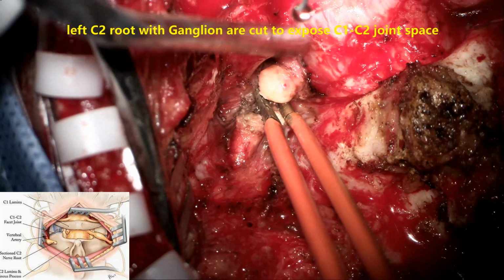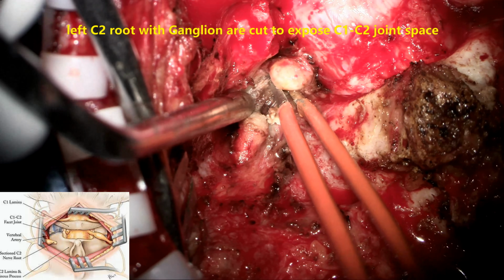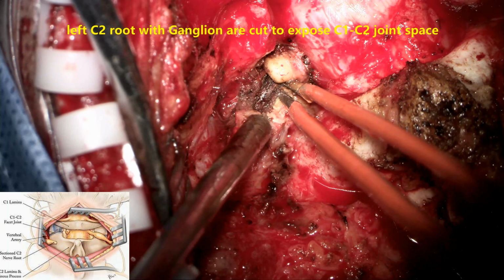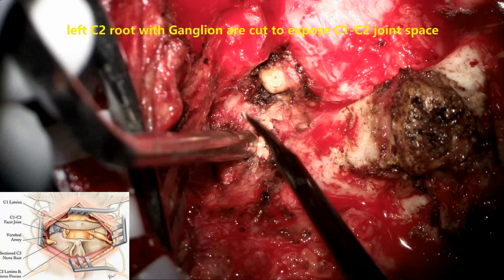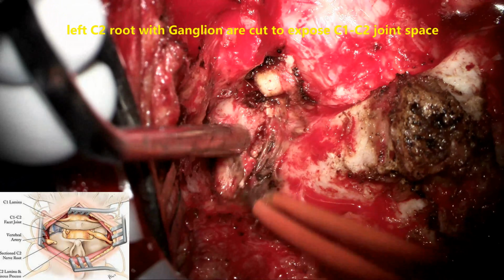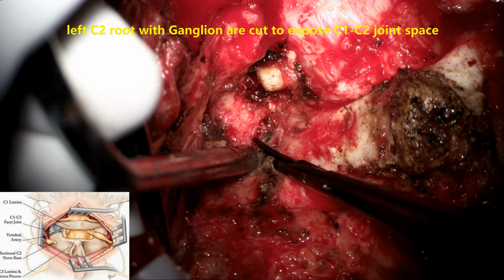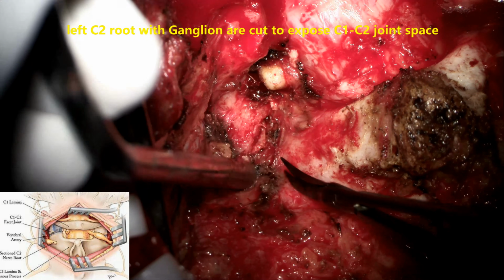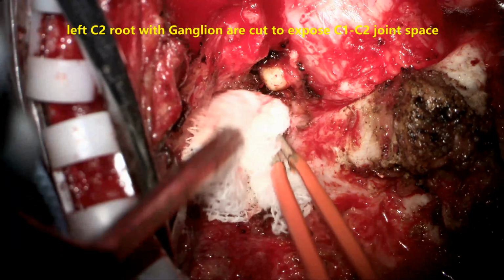Keep coagulating the veins and separating them and expose the lateral C1, C2 joint space. Sharp dissection, cutting the fibrous tissue, cutting the veins after coagulation. The joint space between C1 and C2 is exposed. Already we have placed the traction, so the joint space gets widened and separated.